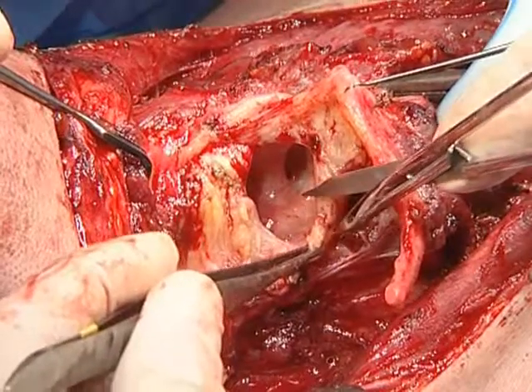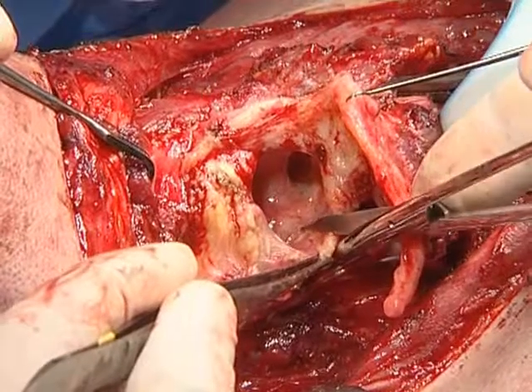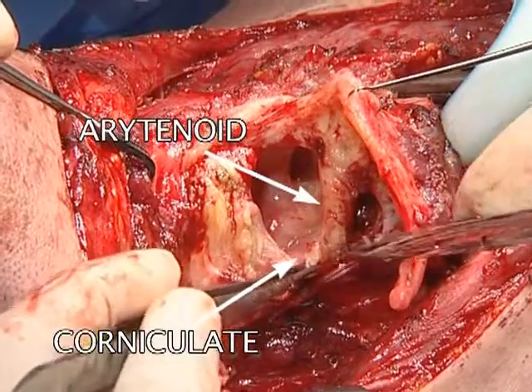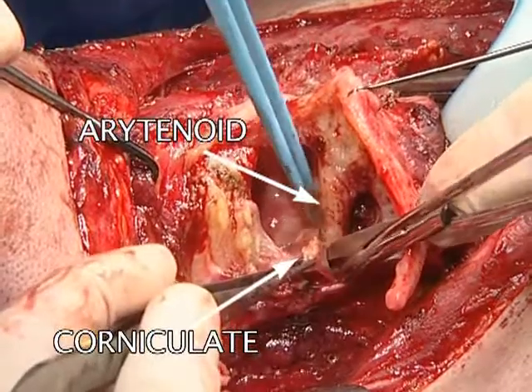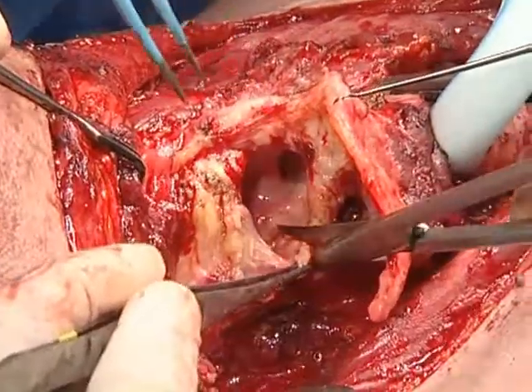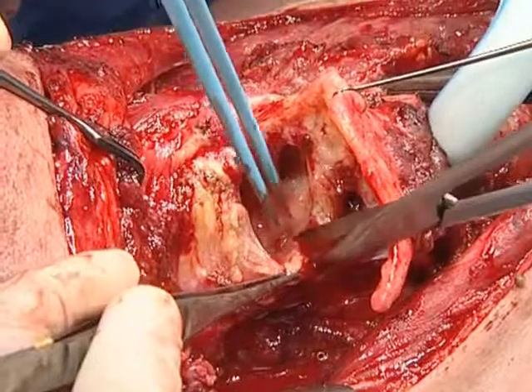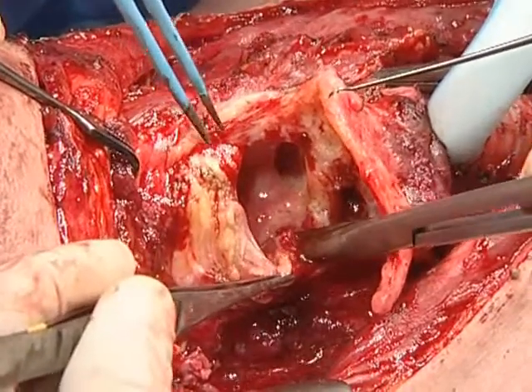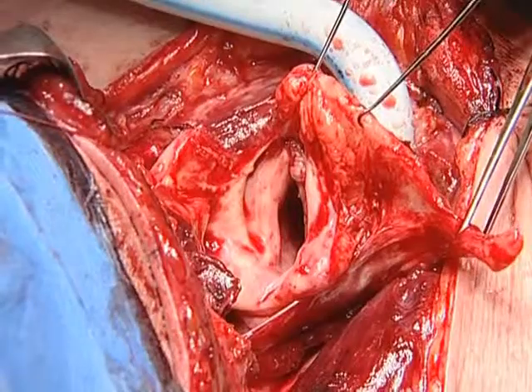At this stage, the aryepiglottic fold will be preserved with incision posteriorly between the arytenoid and the corniculate cartilage. By doing so, the upper margin of the aryepiglottic fold is preserved without danger of an incomplete tumor resection.